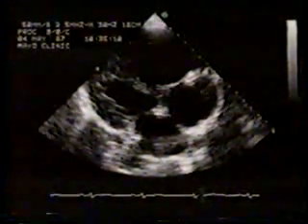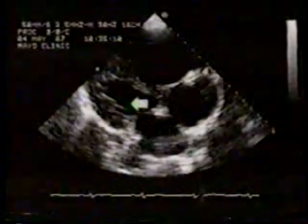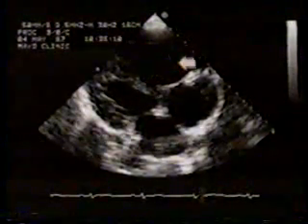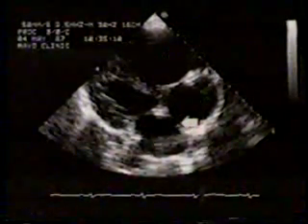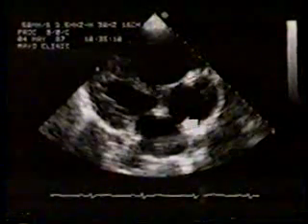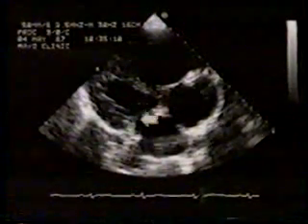This is low parasternal four-chamber view. This is right atrium, atrial septum, left atrium, left ventricle, and this is a markedly dilated right ventricle. Note also that the right atrium is moderately enlarged, and a defect in the mid portion of the atrial septum can be visualized on this frozen frame. The left-sided chambers, in particular the left ventricle, appears of normal dimension.